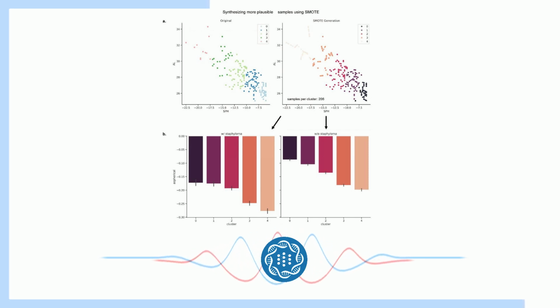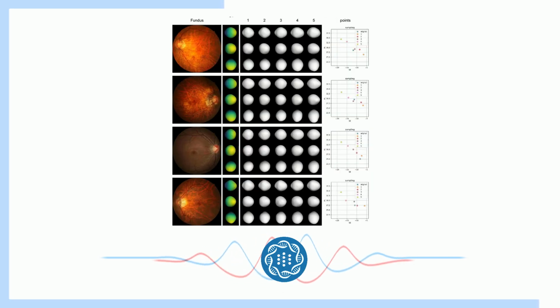Well, one thing they mentioned is that the training data is mainly focused on individuals with high myopia. So we don't know yet how well the AI will actually perform on people with lower levels of myopia or even other eye conditions. So more data is needed, more diversity, as is often the case with AI. Exactly. The researchers acknowledge that expanding their data set to include a broader range of eye conditions and demographics is really crucial. And of course, they're still working on incorporating that OCT data we talked about earlier.